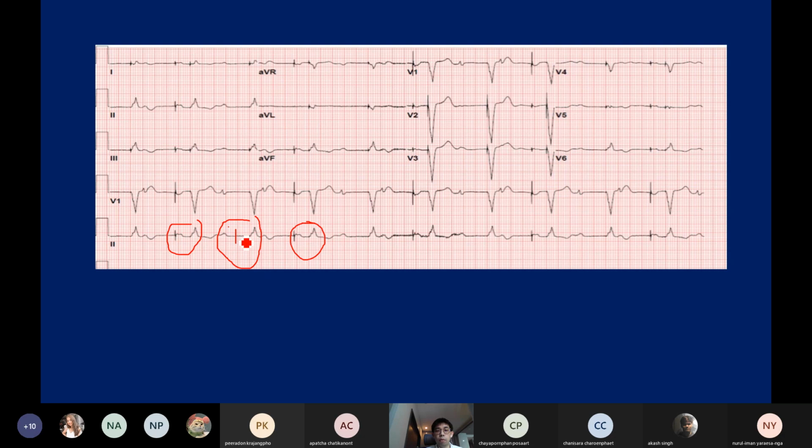But this pacemaker could not trigger itself to pace at this moment. So there shouldn't be any trigger function in this pacemaker. But the pacemaker could inhibit itself if it sees the intrinsic rhythm. So this one is dual pacing, dual sensing, but the response to sensing is inhibit.